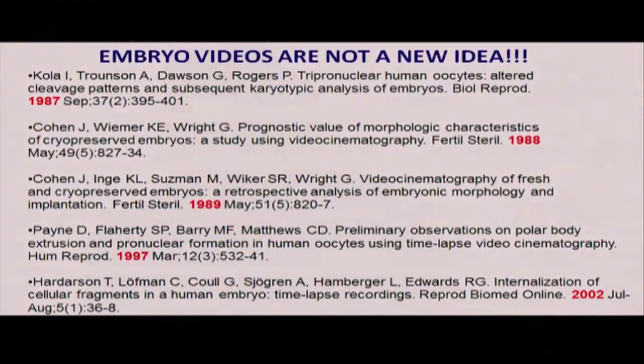So with video technology, we've always thought if we had a nice video technology, we would be able to make these decisions much easier. And this is not a new idea. Since the late 80s, people have been playing around with systems where they've put cameras on microscopes and tried to video embryos. There have been so many studies. Jacques Cohen, who was a speaker earlier today in the Fertility Planit meeting, had developed technologies using videos to take videos of embryos. And there have been a lot of papers where people have tried to video embryos to get a lot of information to see which embryo is the one that will give you a pregnancy. So it's not a new idea.